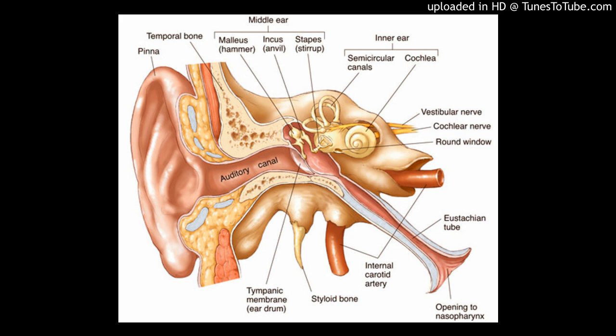Cholesteatoma surgery. The variation in technique in cholesteatoma surgery results from each surgeon's judgment whether to retain or remove certain structures housed within the temporal bone in order to facilitate the removal of cholesteatoma. This typically involves some form of mastoidectomy, which may or may not involve removing the posterior ear canal wall and the ossicles. Removal of the canal wall facilitates the complete clearance of cholesteatoma from the temporal bone in three ways.